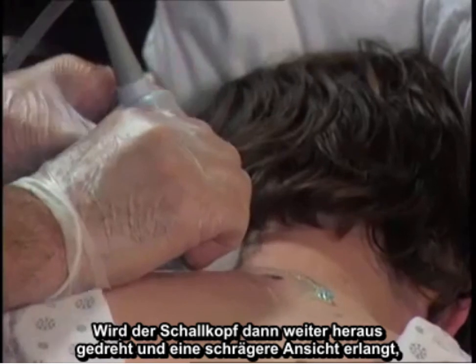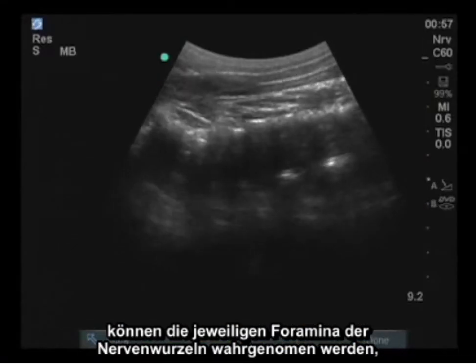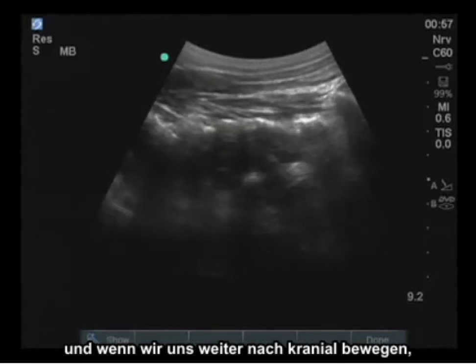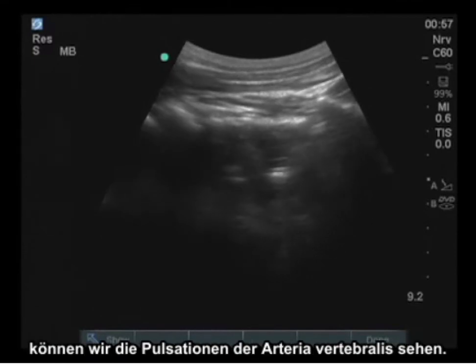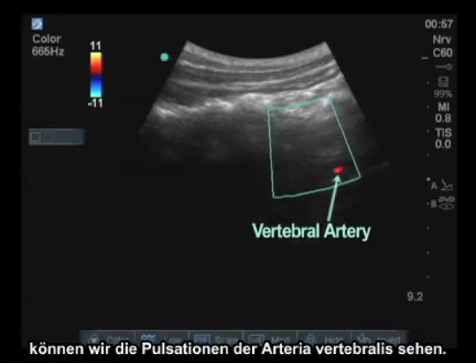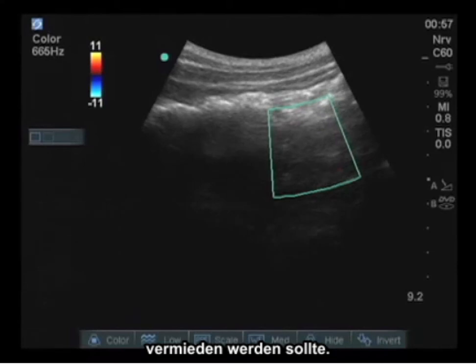If the probe is then rotated further out and a more oblique view obtained, the actual foramina of the nerve roots can thus be discerned. As we move further cephalad, it is possible to view the vertebral artery pulsations. This obviously is a structure that would want to be avoided at all costs.